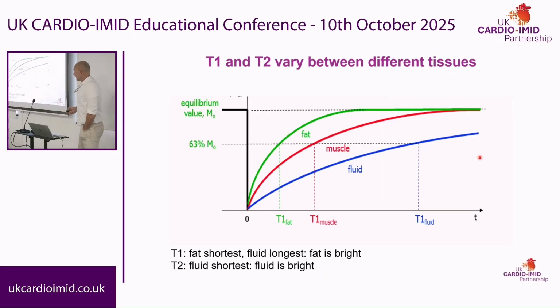So how do we use that for imaging? So the next fortuitous thing is that different tissues have different T1 and different T2 properties. That's all related to how closely linked those protons are, you know, what's in between them. You can imagine you've got soldiers that hold on to each other. It's much easier to walk in sync. If they all walk separately or they haven't got strong bonds, it's easier for them to desynchronize. And that's why different tissues have different T1 and different T2 properties.